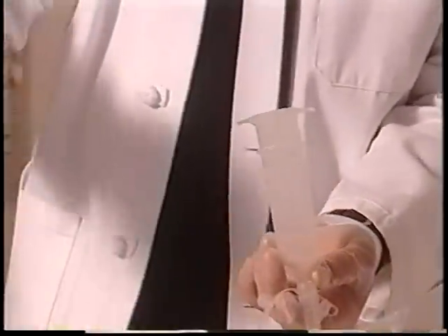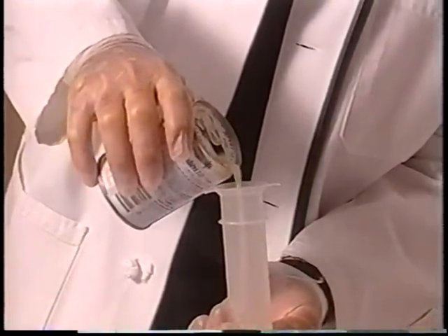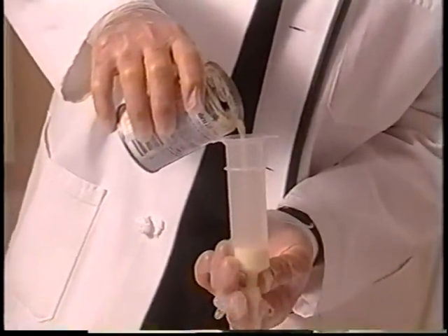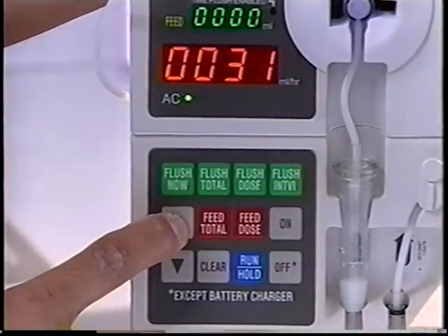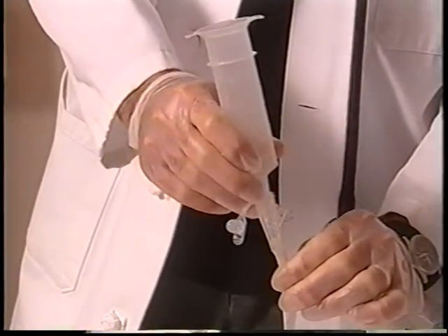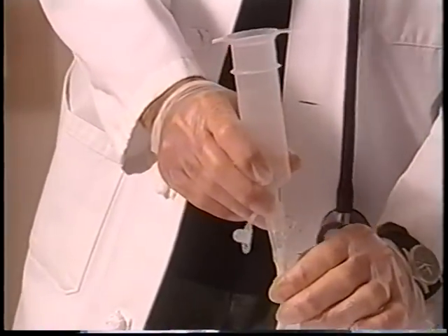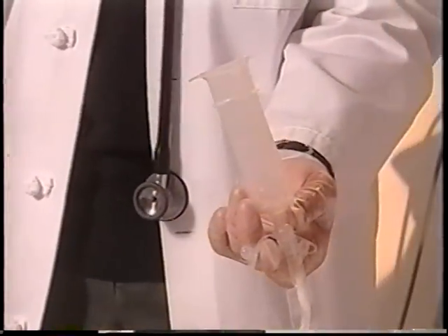The flow of formula during a PEG tube feeding is regulated according to physician guidelines. It can be delivered via a bolus method using a syringe, or by a continuous method which utilizes a pump. Bolus feeding allows for delivery of formula over a short period of time. The technique will vary depending upon the PEG device that the patient has in place.